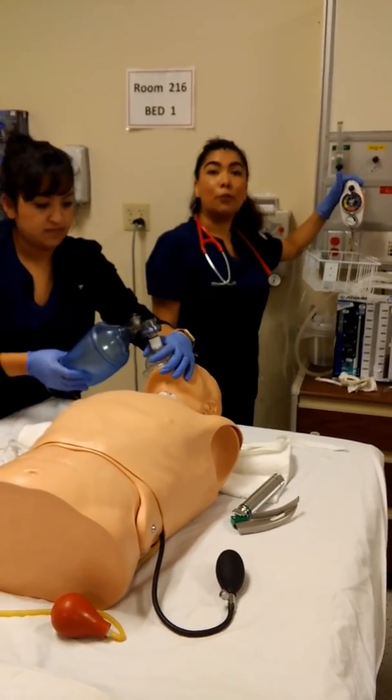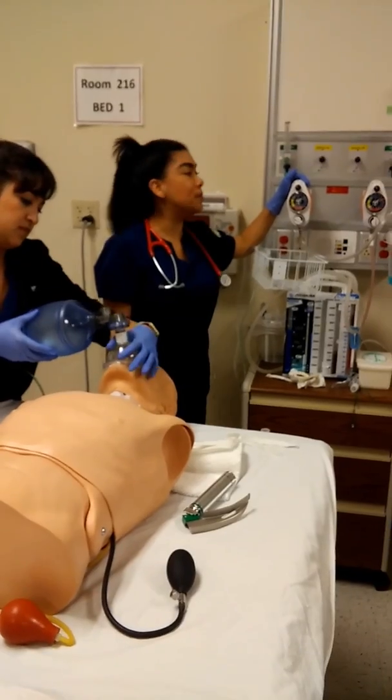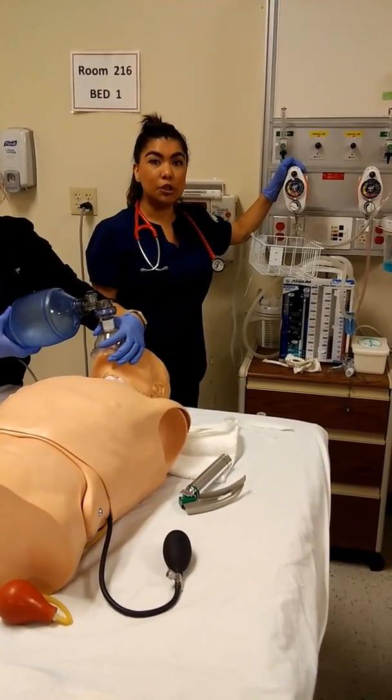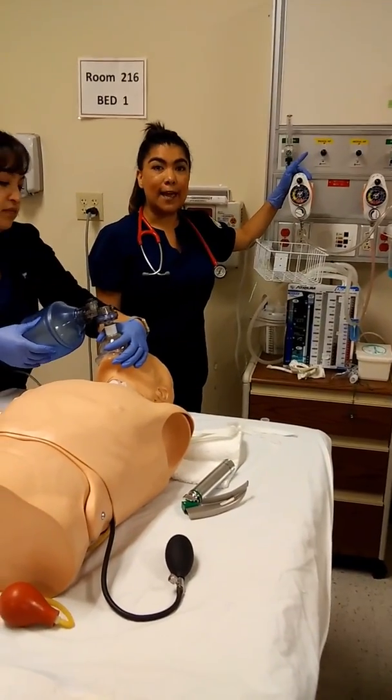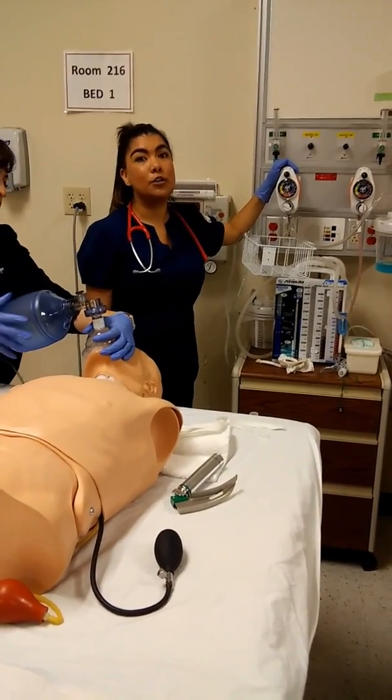So we would be able to crank this up so that we could provide 100% oxygen. We want to check our pressures in case the patient is going to need some suctioning. So if it were an infant, the pressures would be 80 to 100. If it's a child, it's going to be 100 to 120. And for this case, for an adult, it's 120 to 150.